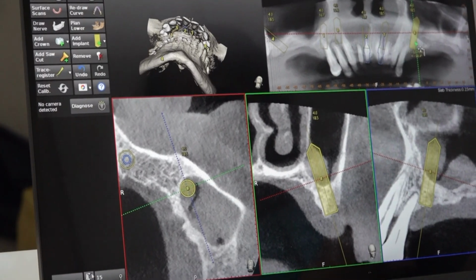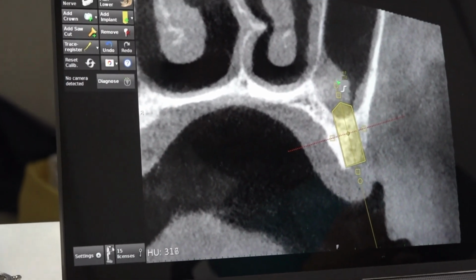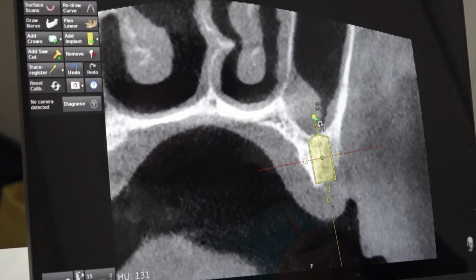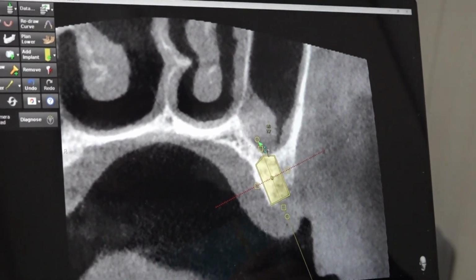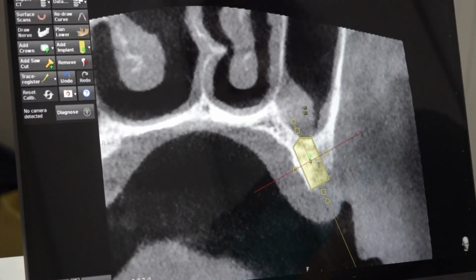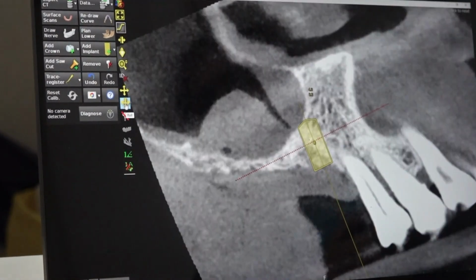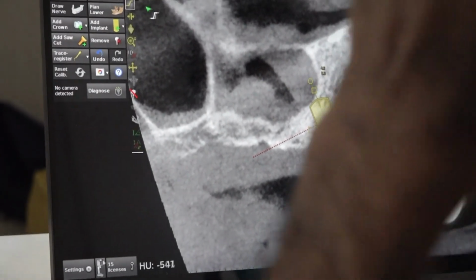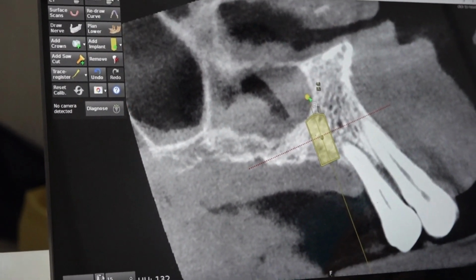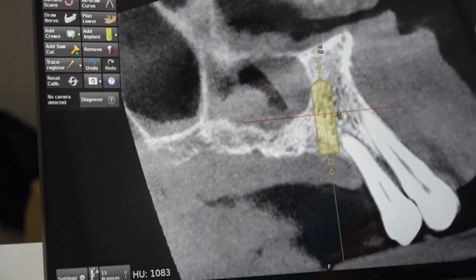So this is the second premolar, straight axial planning. Only how many mm? 8 mm. If you tilt slightly palatally, you can increase a little bit, maybe 8 or 10 mm. Now if you tilt mesially, you can beautifully see the sinus coming in front till the premolar. Now how are we avoiding the sinus? Tilting. So this is the basis for all the tilting concept, All-on-4. That tilt, this tilt.